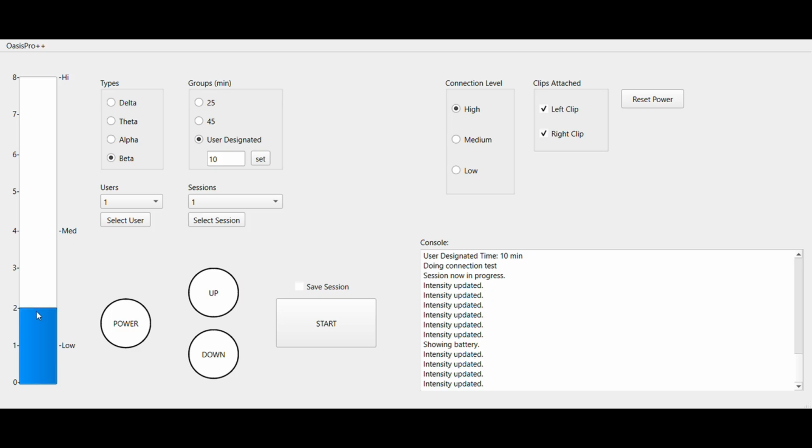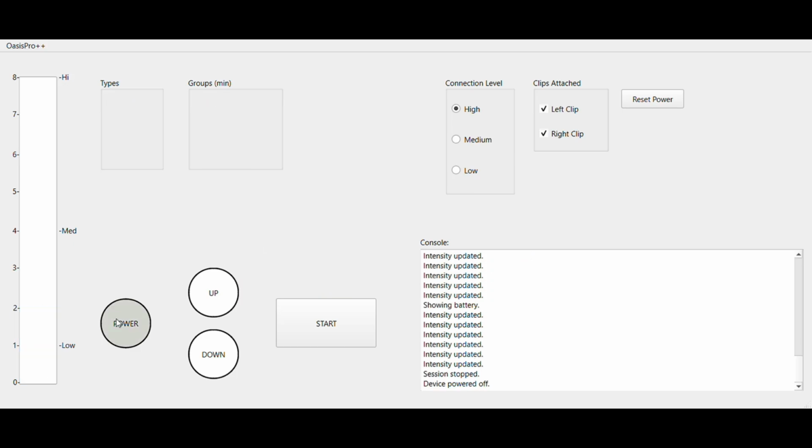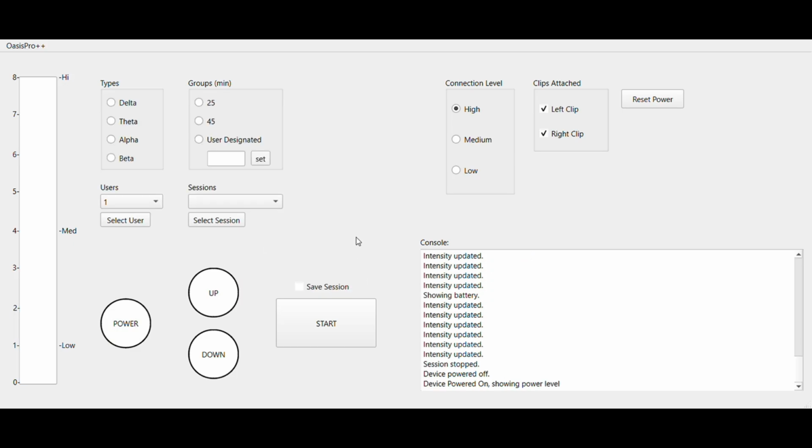You'll see it'll soft off, the device powers off again. You resume, see the battery levels there. What would happen if you were to, let's just select user 3? You'll see that the session's not there. That's because the session that we saved belongs to user 1.